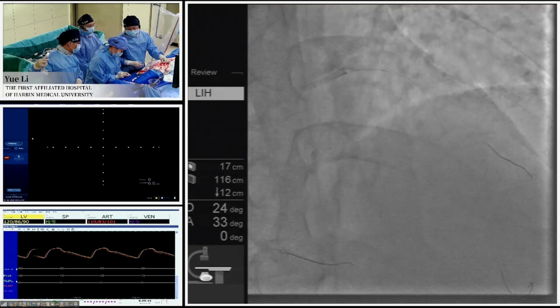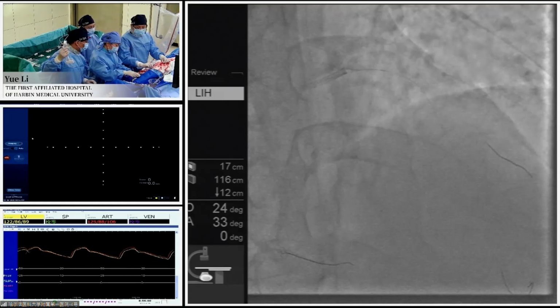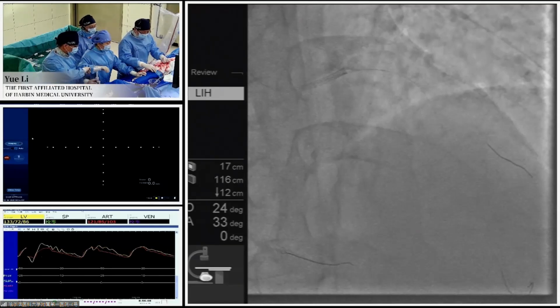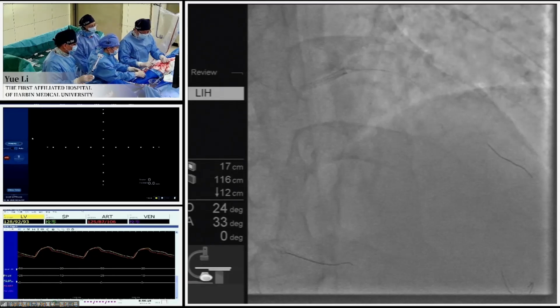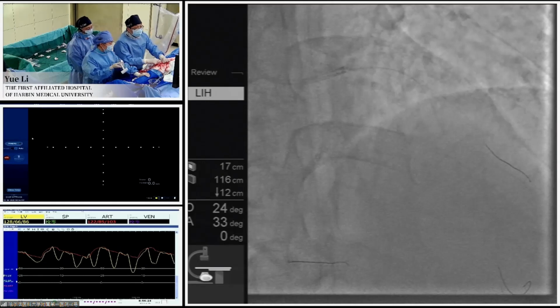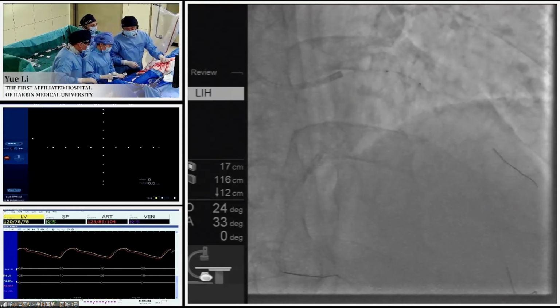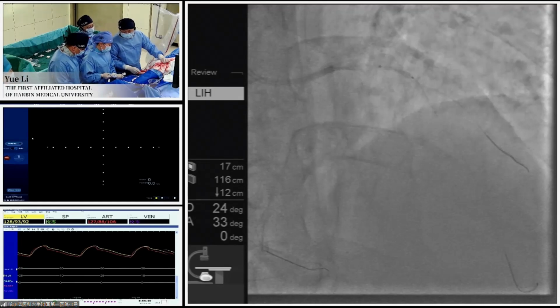Although recently the intraplaque, within-vessel-architecture theory is very popular, in the proximal LAD we do not want to take the risk of losing a very big side branch, even the circumflex. So Professor Li stopped the blind advancement of the retrograde wire, used the Gaia from the antegrade side to meet the retrograde wire, and finally made the retrograde wire go into the antegrade guiding catheter. Professor Li then performed the rendezvous technique. We can see that this saves a lot of time, and it is a very quick procedure to push the antegrade microcatheter into the true lumen. Now that we have changed the antegrade wire to a working horse wire, we are using the balloon to open the proximal occluded segment.